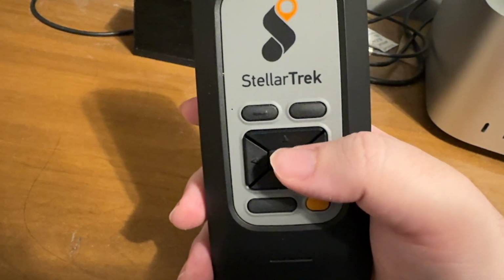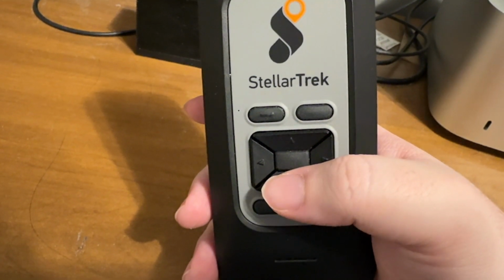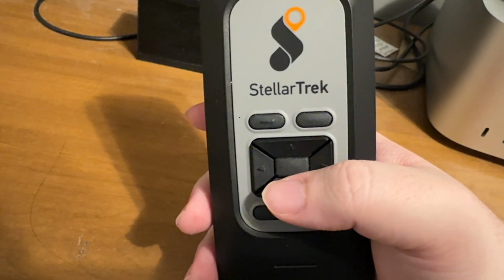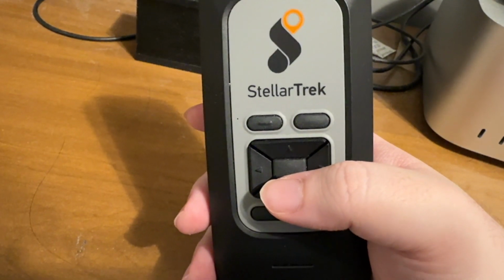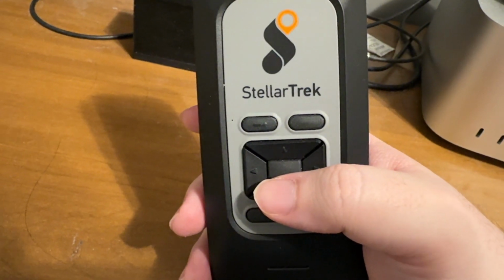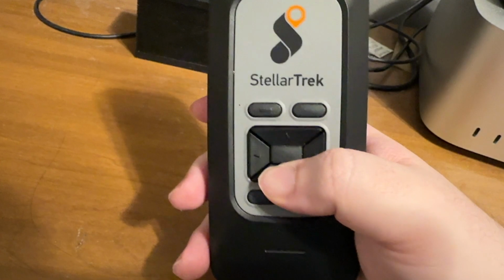Before we look at entering an address, I do want to quickly show you how you can adjust that to your preferences. If you saw the unboxing video, you'll remember that this was asked during the setup wizard. When we first booted up the device, we were taken through a series of questions, and that was one of them. But if you want to change this later, I'll show you how. What we're going to want to do is press and hold the down arrow key.